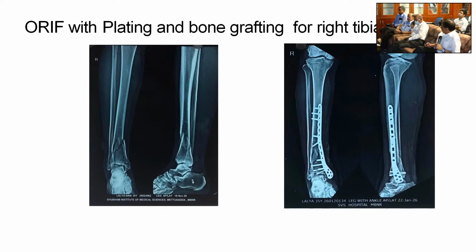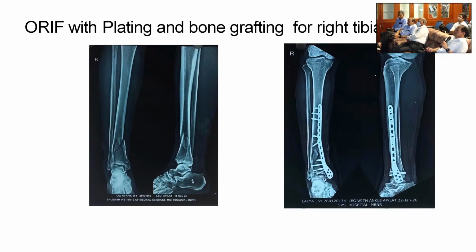Who is Rajshekar, your unit? I think there is a fracture here, is it? One fracture there, and that one is there. Probably would have been, but you should have tried one screw, just a normal screw, because Herbert screw is not going to hold here. Herbert screw, because it needs compression here. So one with the reduction, screw across, and maybe not too big. The plate is too big for this.